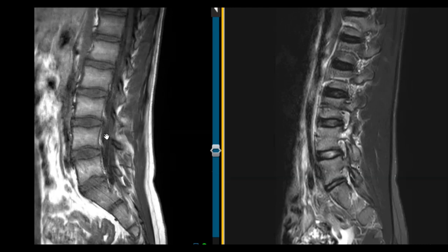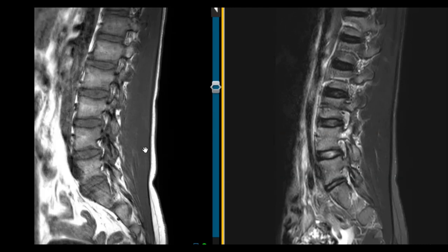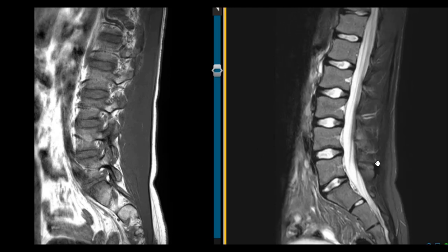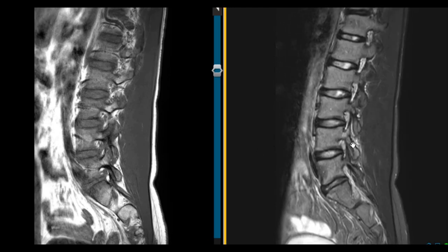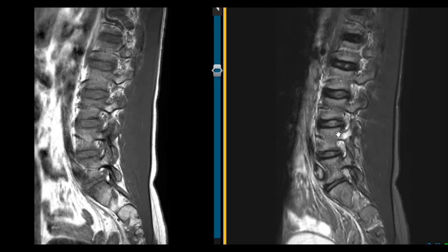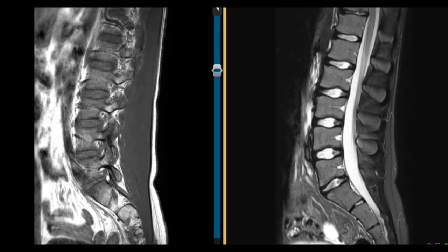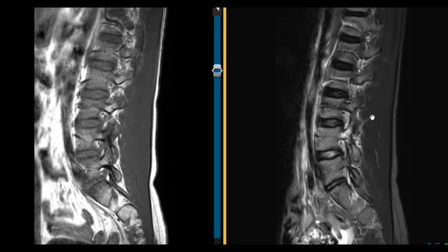That was on one side; we're going to go to the other side. Here's the left side — an area of darkness there, so it looks like there may be a little vertical fracture right there through the PARS intraarticularis. So this is a child who has a falling injury, and again, marrow edema back in this characteristic location — bilateral PARS defects or bilateral PARS stress injuries.